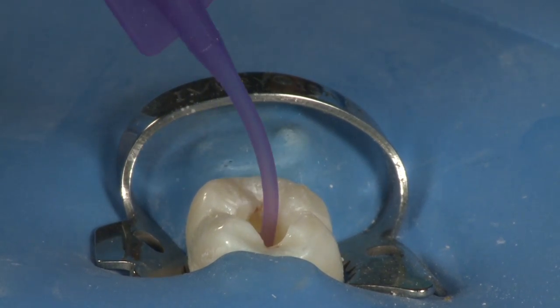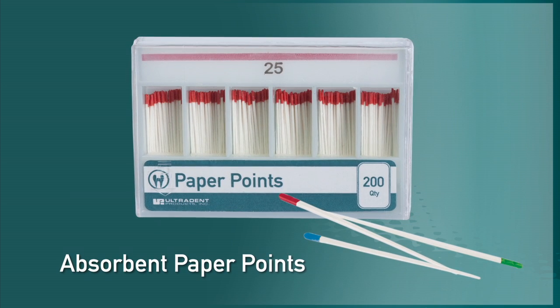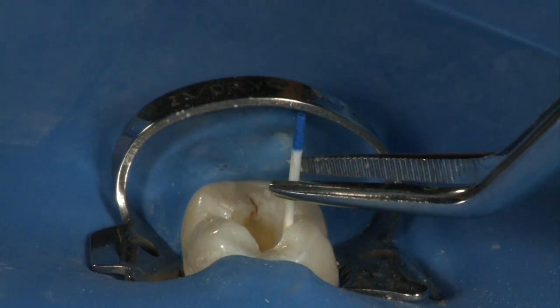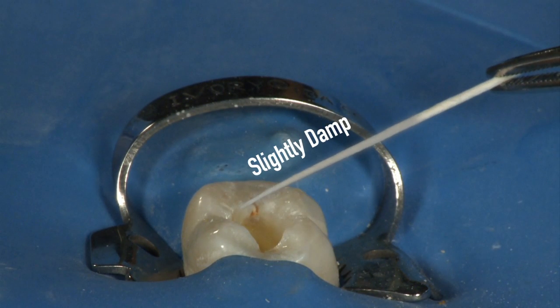Evacuate one last time with the Luer vacuum adapter to remove the Consepsis from the canal and blot out the canals using 1-2 paper points. Because we will be sealing the canal with EndoRes, it is not necessary to desiccate the canal. Leaving the canal slightly damp will provide the best environment for EndoRes to penetrate into the tubules.